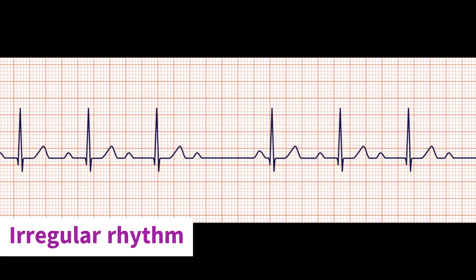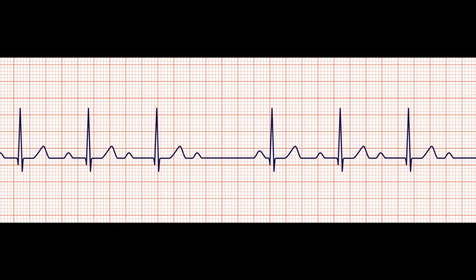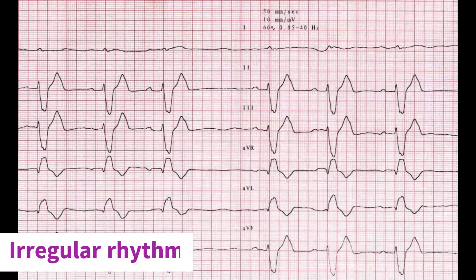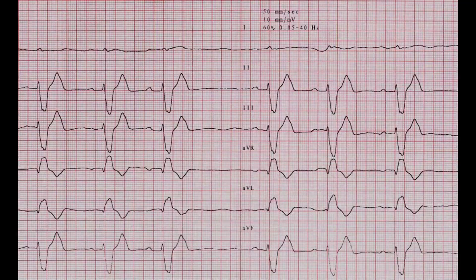This EKG rhythm is definitely irregular. You can tell by the unequal R-R intervals. And here is another example of an irregular rhythm on a 12-lead EKG strip.